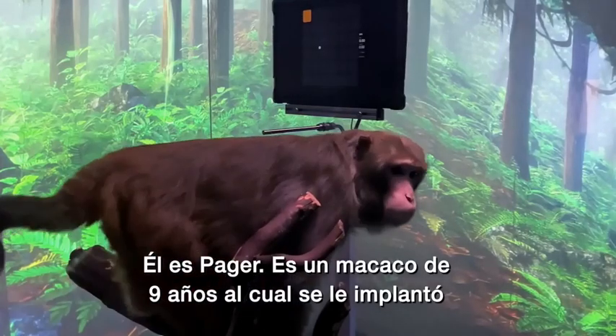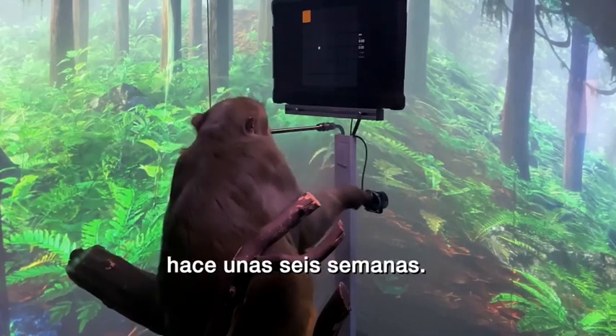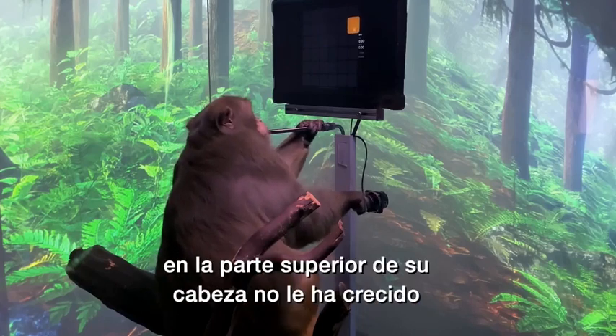This is Pager. He's a nine-year-old macaque who had a Neuralink placed in each side of his brain about six weeks ago. If you look carefully, you can see that the fur on his head hasn't quite fully grown back yet.